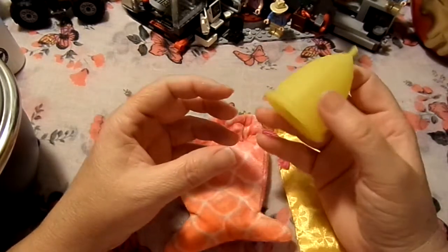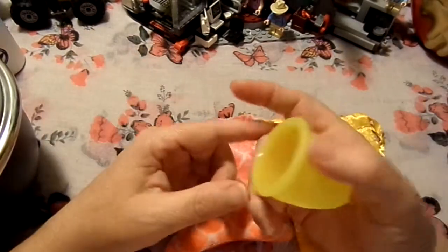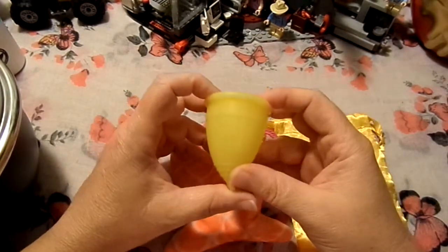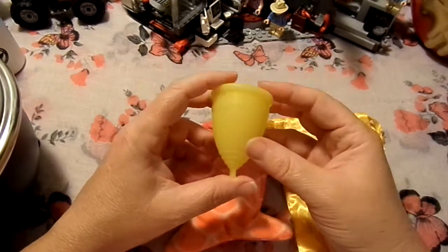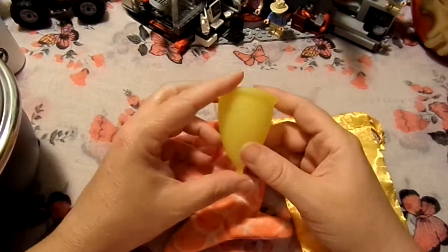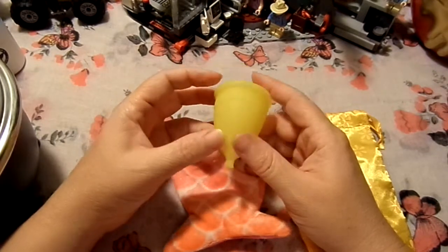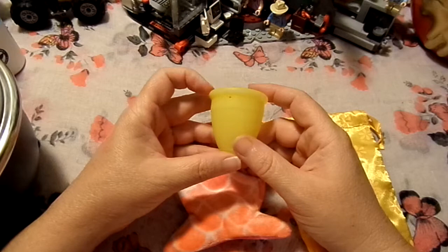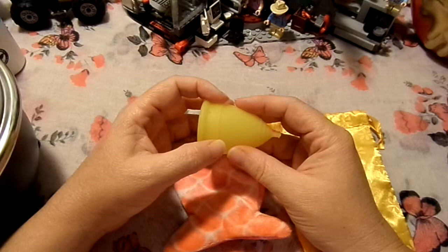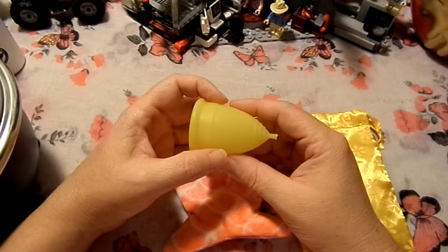If you have questions about how to find your right size, you can either ask me, or there is another channel here on YouTube called Put a Cup in It, and they have quite a few videos about finding your right cup, or your Goldilocks cup. I have a very high cervix, so I tend to go for a bigger cup. Most companies will offer it in 2 sizes, and they'll say size 1, which is generally the smaller size, is for women under 30 or women who have not given birth, and size 2 is for women who have given birth or those women who are over 30.